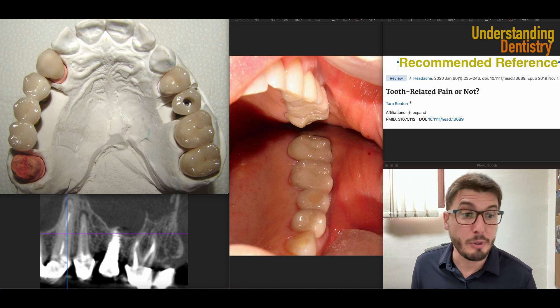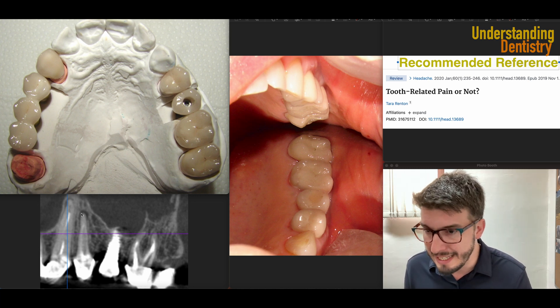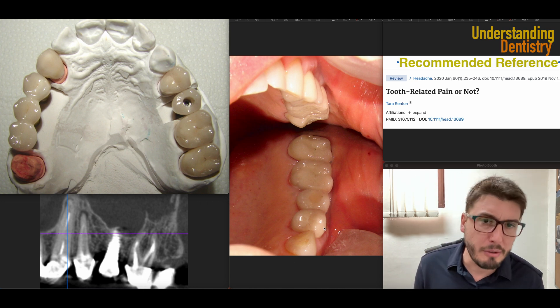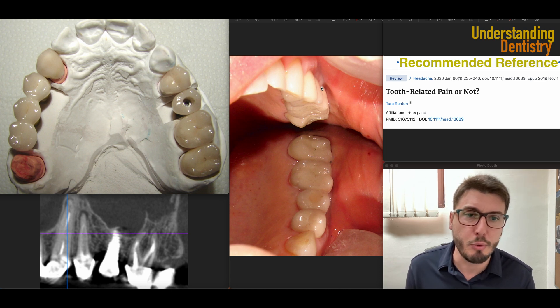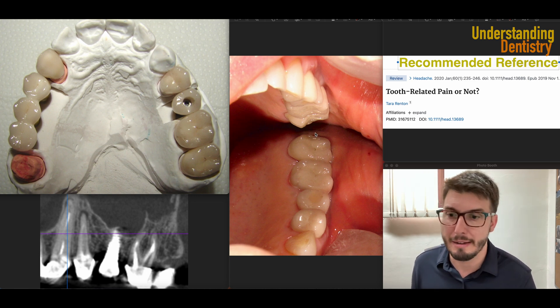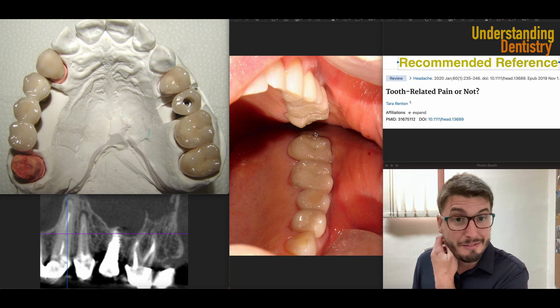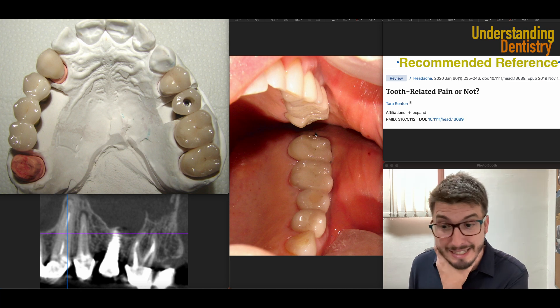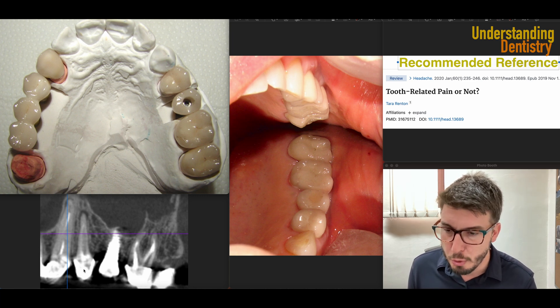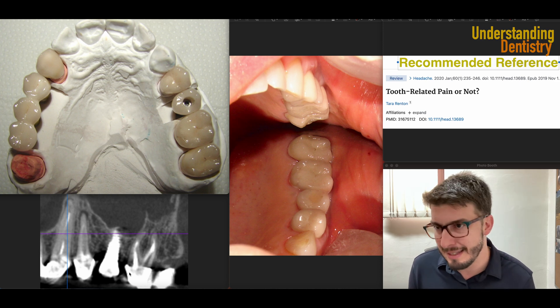There is a CBCT, but let's first navigate through the scenario as if you have an OPG or just a 2D radiograph. Clinically, you start with your clinical examination — soft tissues were okay, and the adaptation of the crowns on the gingival tissue was at least reasonable. So the clinical exam is not telling us a lot, and then of course you go to radiographs. There is a lot of metal from these crowns, and you can see the radiopaque aspects of the metal.